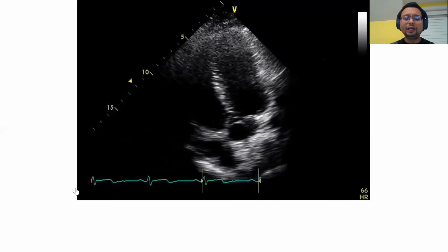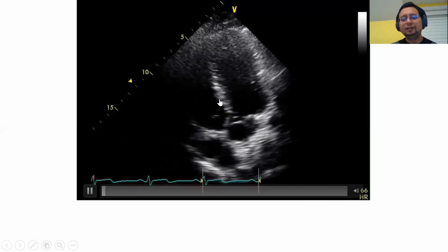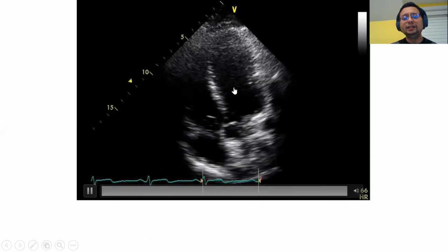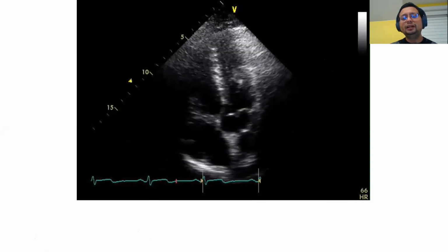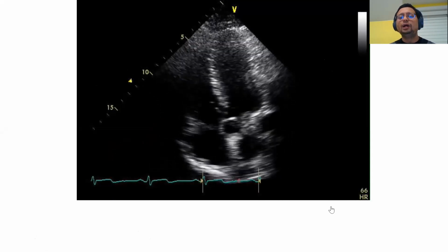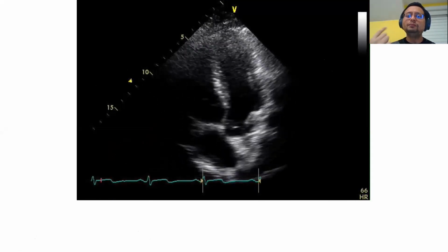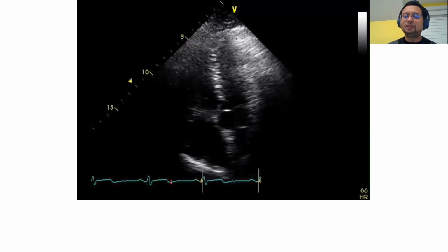Now, what about this echocardiogram here? Okay, if someone can tell me what they are seeing? Okay. Look at the septal movement. Okay, right. It moves towards the left side on inspiration, expiration, inspiration, expiration, inspiration, expiration. So those of you who have come to see my talk before, septal shift with respiration exaggerated. What is the first thing you need to remember? Need to think of constrictive pericarditis. Okay, so this is a patient with constrictive pericarditis.